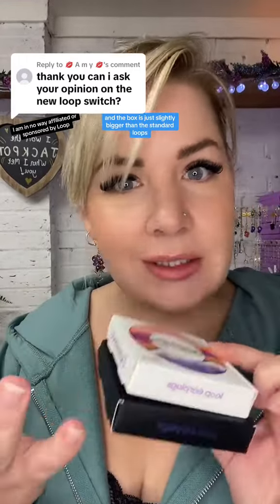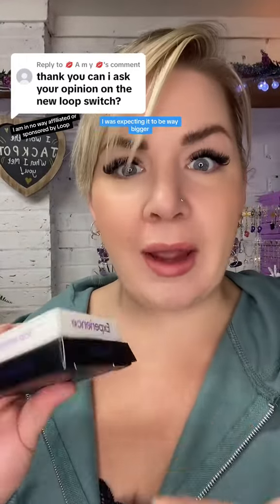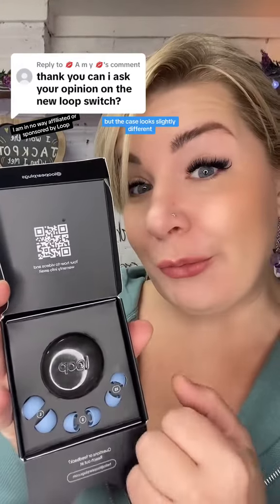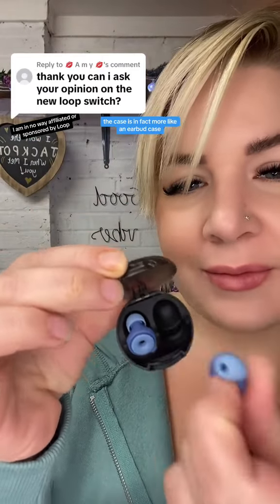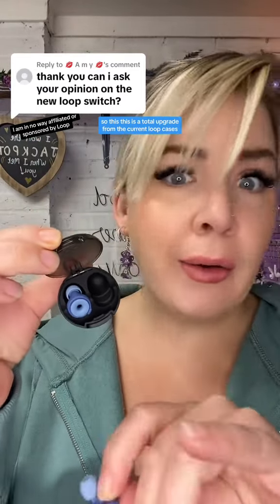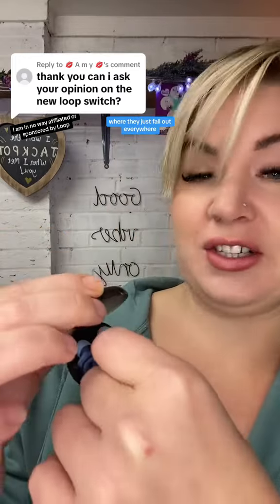The case is super cute — like holographic, really cute. I ordered the blue ones and the box was just slightly bigger than the standard loops; I was expecting it to be way bigger. Inside you have the same ear tips as you do with other loops — so experienced, engaged and quiet — but the case looks slightly different. The case is in fact more like an earbud case, which is a total upgrade from the current loop cases where they just fall out everywhere.